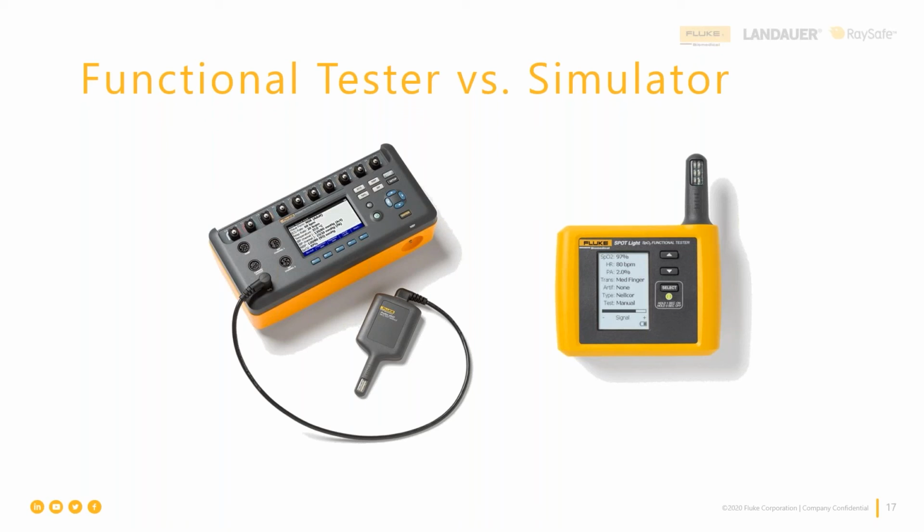So just to make it really clear to everybody, the Spot is the artificial finger that attaches to the ProSim 8. It is an optional accessory. And the ProSim Spotlight is a smaller version of the same thing, with fewer R curves built into it. They're both functional testers. I did also add that application note that you just mentioned to our handout section of the available content for you today. So just wanted to let you know that it's available right now as well. Very good. Thank you, Lindsay.